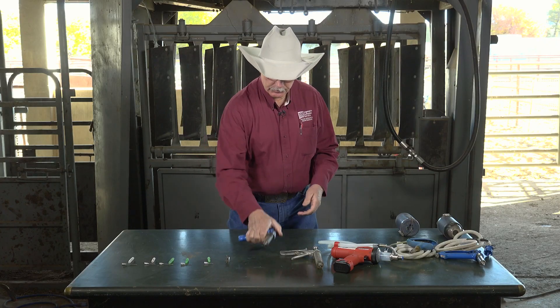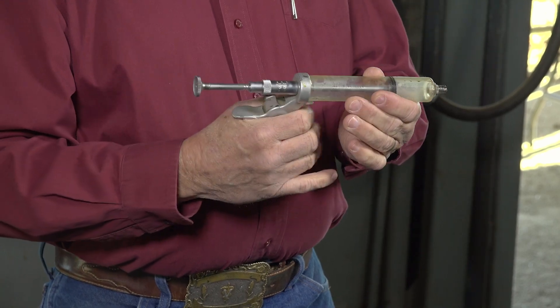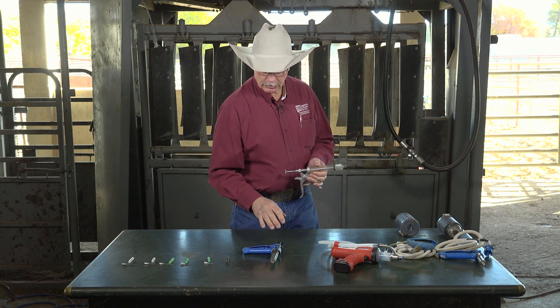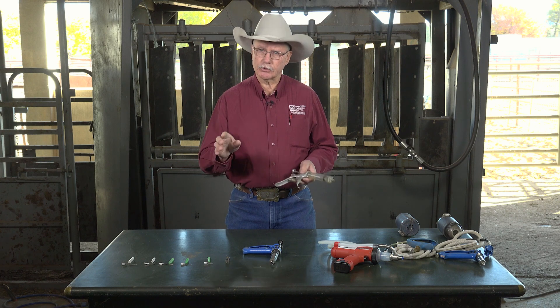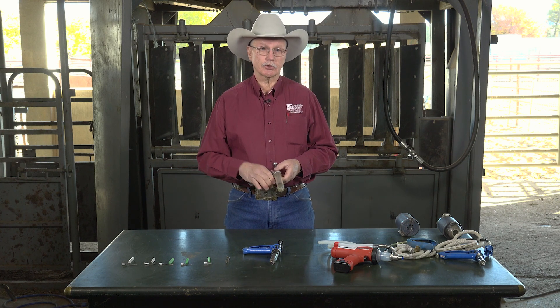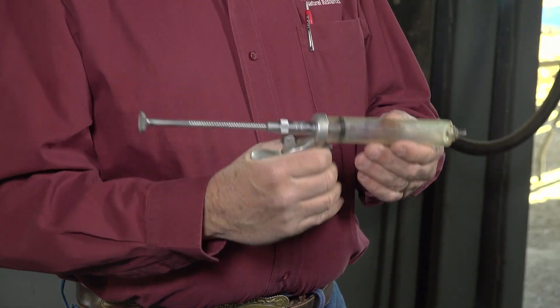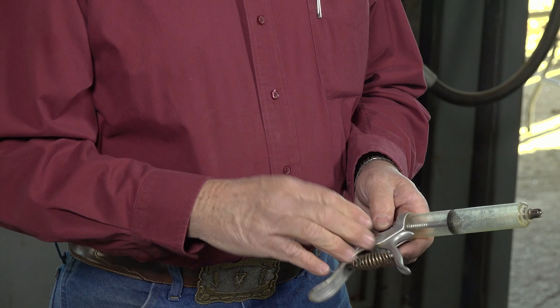These are a couple of different types — they're both designed the same way and are adjustable. You can use them for given smaller dosages, and especially when certain products have small dosages like 2cc, I would prefer to use a smaller barreled syringe so that you're more accurate in the dosing. Because sometimes with these 50ml barreled pistol grip syringes, they may not be as accurate when you're only delivering 2cc products.